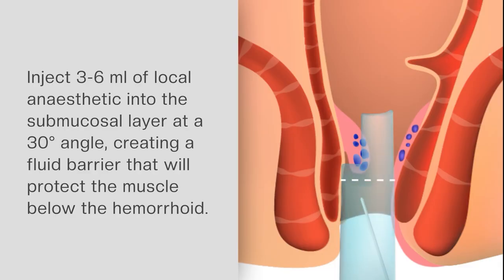However, if we want to use the same 30 milliampere current without general anesthesia or spinal anesthesia, we can use local anesthesia by injecting lidocaine or any combination we determine, such as a mix of lidocaine and procaine. We can inject it at the 2 and 10 o'clock positions around the anal canal or directly around the anus. With any of these current settings, we can proceed. That is, once we've injected the anesthetic, we can treat the patient using the 30 milliampere current.